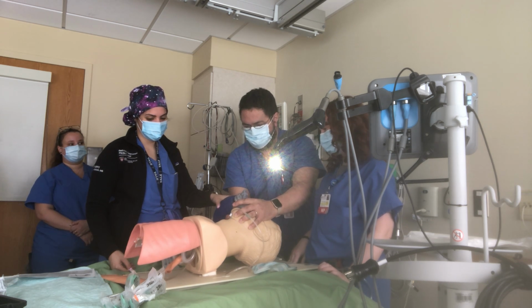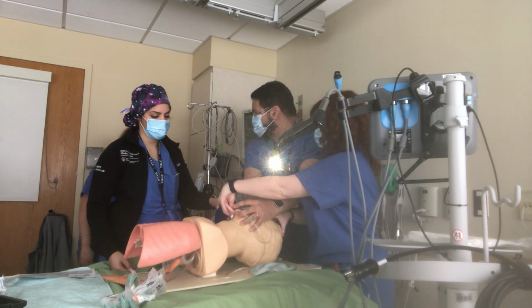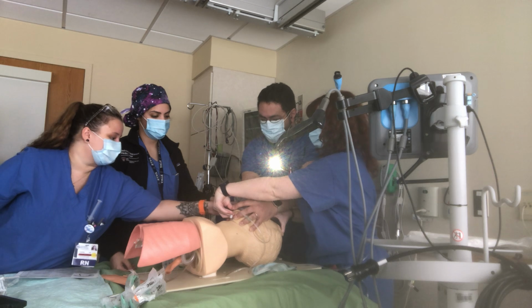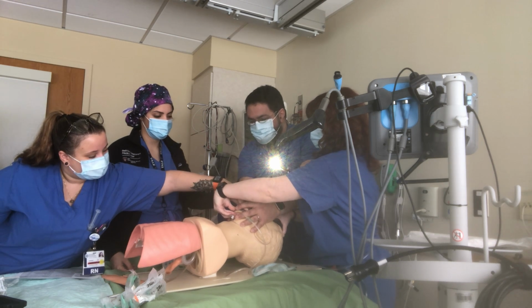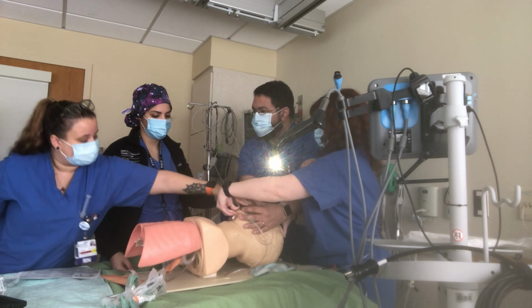Anyway, so right here, we did like this, right? You still don't have a seal. So what are you gonna do? You find where the seal is, right? You put your finger there so you can see the air coming out.